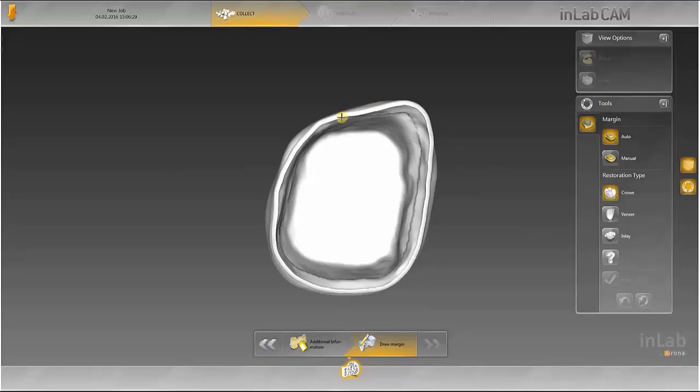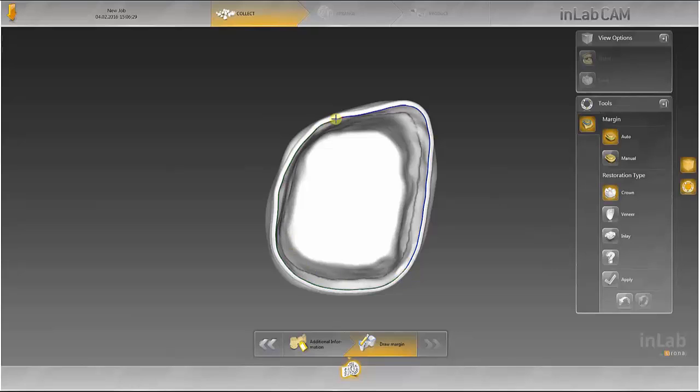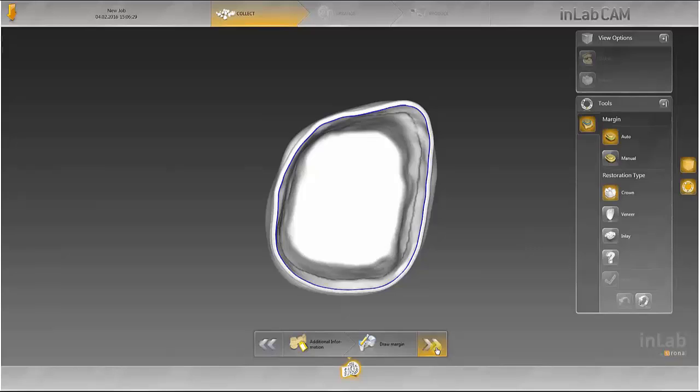The margin line is set by double-clicking. Clicking Apply saves the line. Clicking the next arrow saves the crown to the design list.